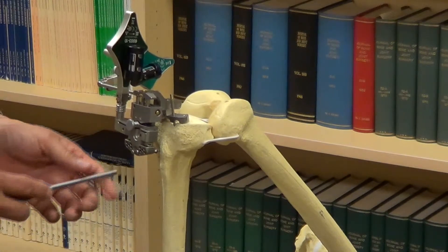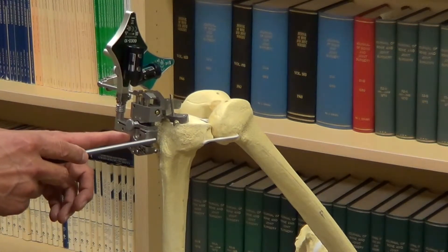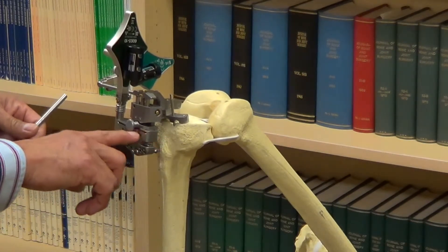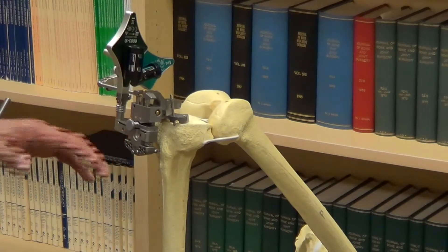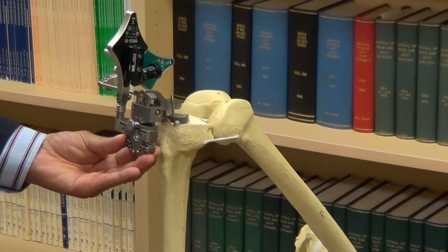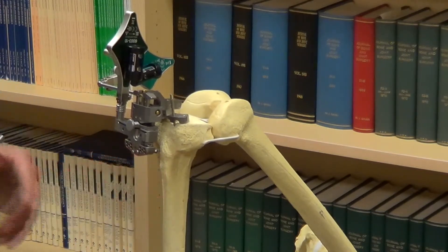Once we're happy with it, we'll end up putting four screws to fix this bony block to the end of the bone. From this, we can use a cutting saw to flatten or cut the top of the bone once the computer has been removed. By leaving this block in here, one has a better ability to precisely adjust the bony cuts for the tibia.